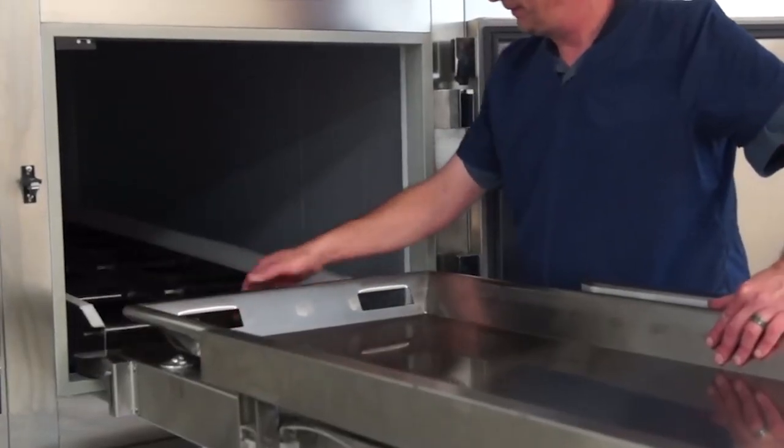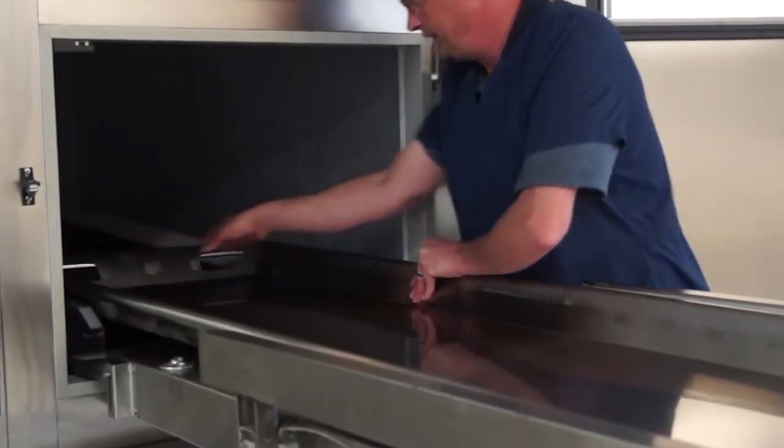Please speak with your Mopec representative to determine which Red Wing lift model is right for your facility.